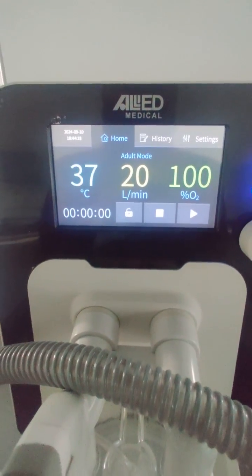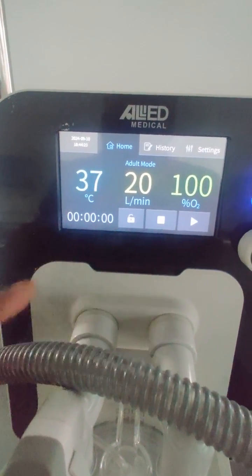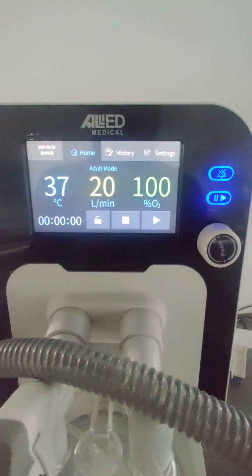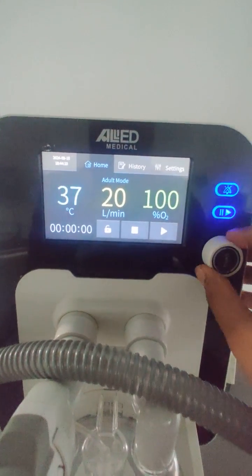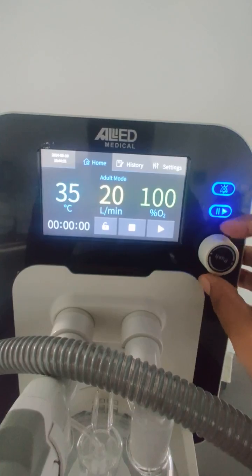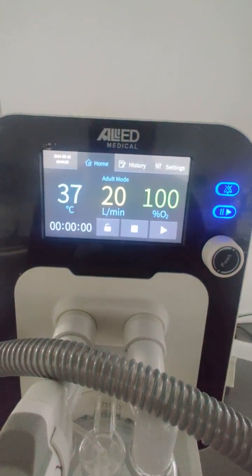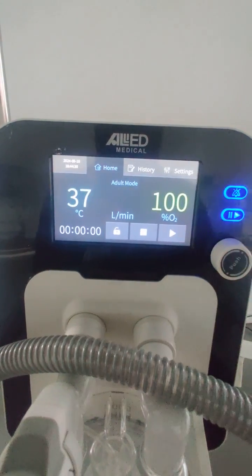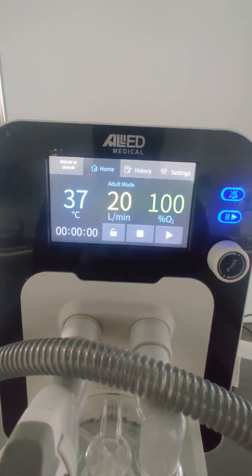On the display, these are the parameters you can set using the touchscreen or by adjusting the knob to increase or decrease values. The temperature range for the breathing gases is from 31 to 37 degrees Celsius. This machine is operable in both adult mode and pediatric mode.